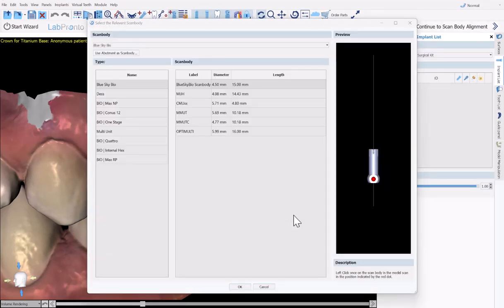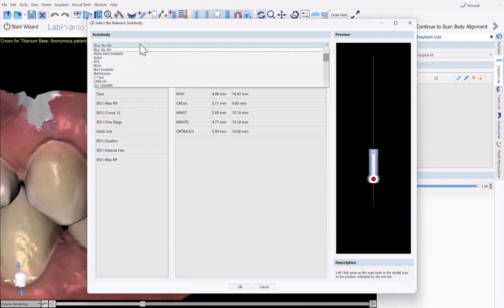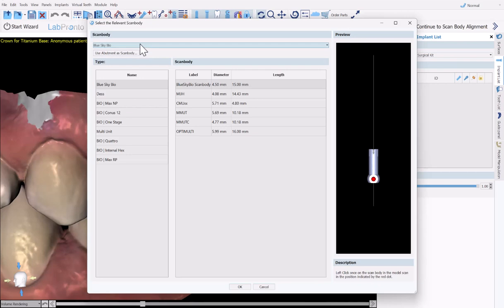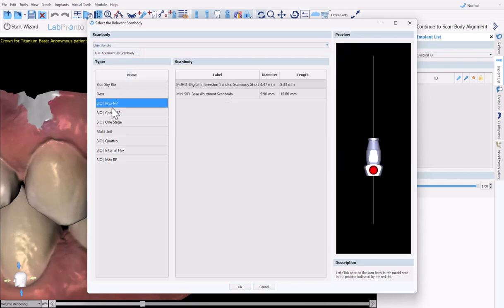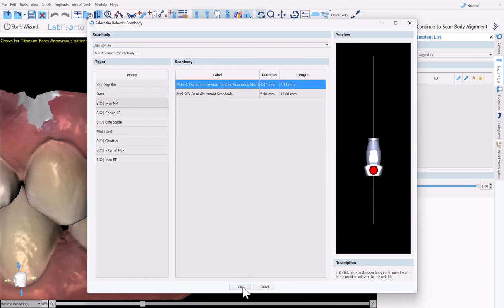We are now going to navigate to the correct scan body. We have a list of companies here. You could choose the relevant company for the scan body you are going to be using. Of course, we encourage the use of the BlueSkyBio scan bodies, and we even have the ability to use abutments as a scan body. You're able to actually take advantage of this functionality. If you have an abutment and you have a scan with that abutment, you could align the library abutment to the digital abutment in the scan. In our case, we're going to select the Biomax NP scan body and then click OK.